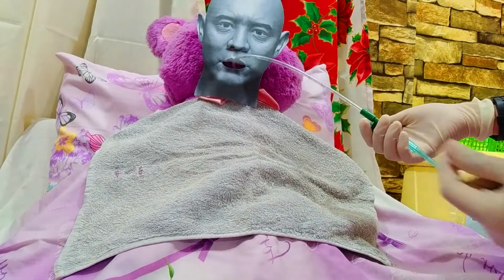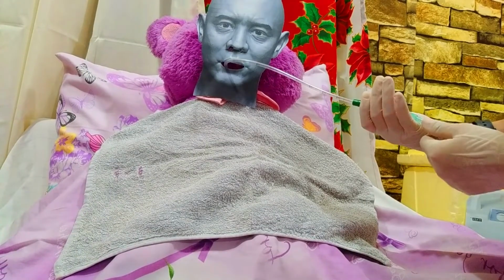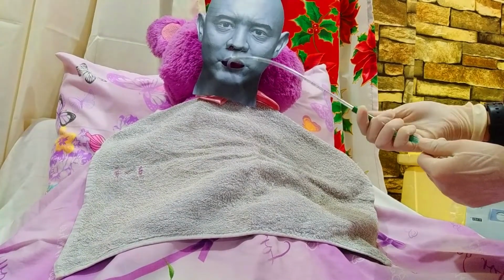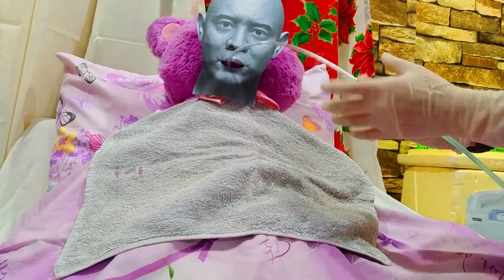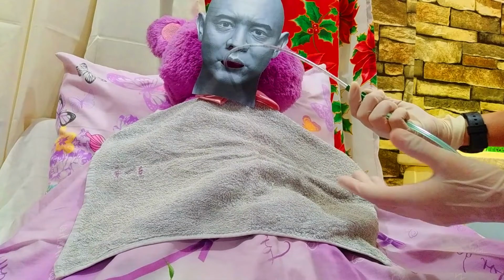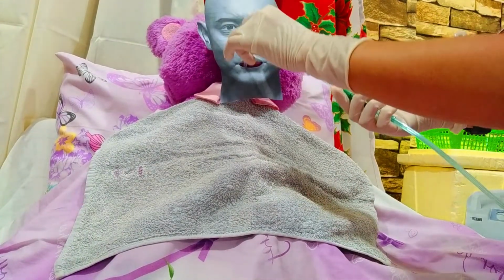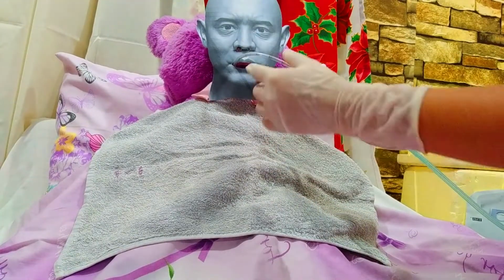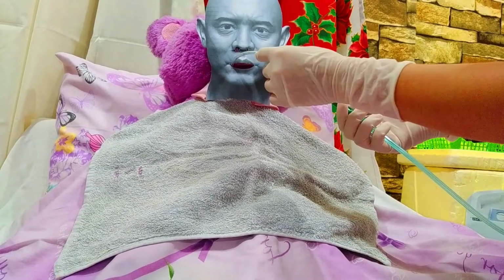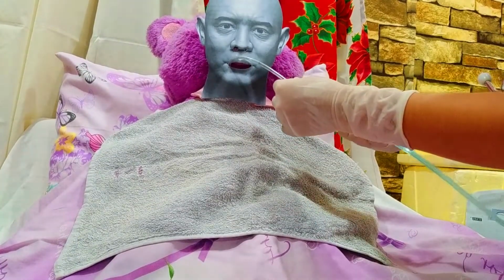And then we need to apply the suction by intermittently occluding the suction valve on the catheter with the thumb of my non-dominant hand and continuously rotate the catheter as it is being withdrawn. And then suction only on withdrawal, and do not suction for more than 10 to 15 seconds at a time to minimize tissue trauma.